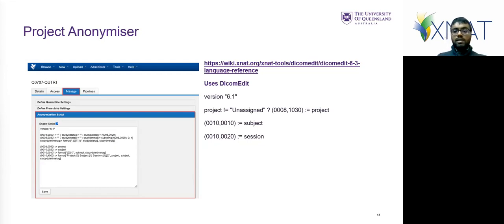I might just quickly address this question. If there's no project data, how do you know who owns the data on the pre-archive? Data sets that are uploaded without proper project information do not get labeled with any project, so users can't see them. You can only see pre-archive data sets that you have access to. The ones a user can see will be things that have data set collision, so there'll be partial data sets. The ones that don't have project data will be called unknown data sets, and that's something that admins will have to figure out.